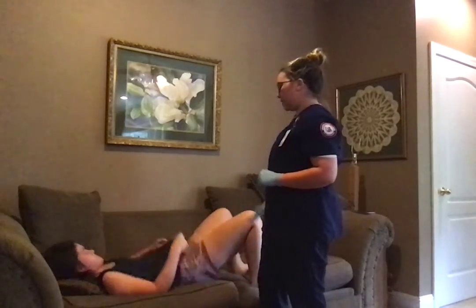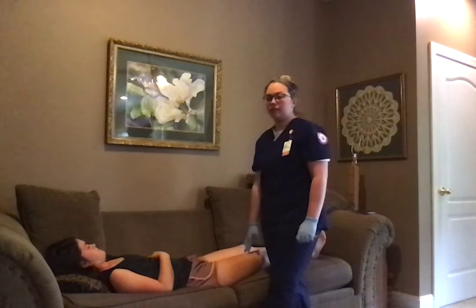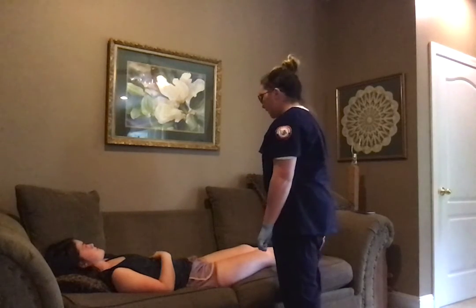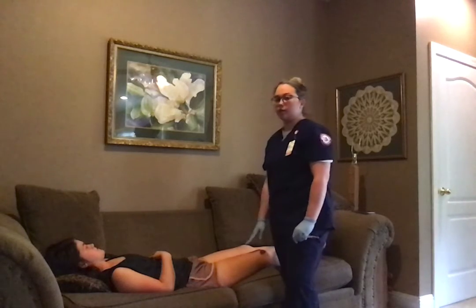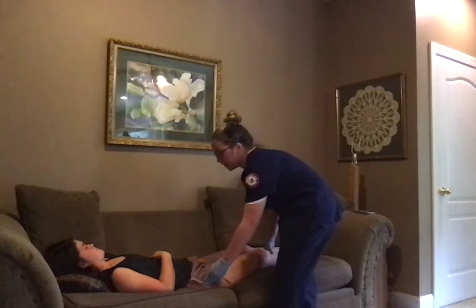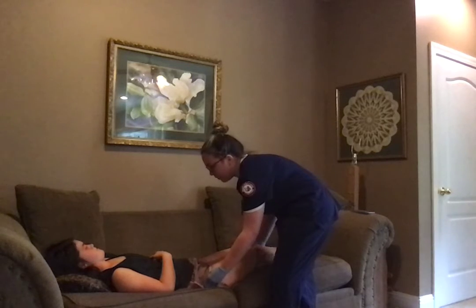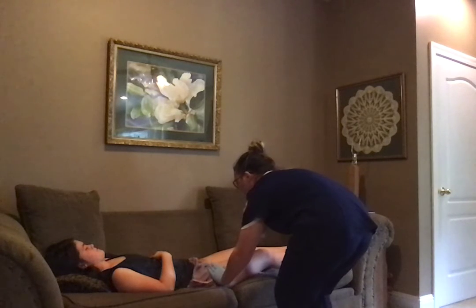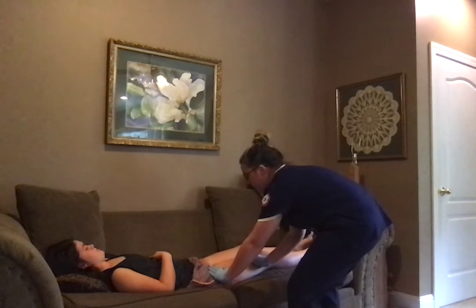So the last injection site that I'm going to talk about is the vastus lateralis. It is located on the anterior portion of the thigh. This is the largest injection site that we have for intramuscular, and it can also be used for subcutaneous. So my landmarks for this injection site are, again, the greater trochanter. I will locate it by moving my patient's leg up and down. And then I'm going to go a hand's breadth down from the greater trochanter, and I'm also going to go a hand's breadth up from the knee.